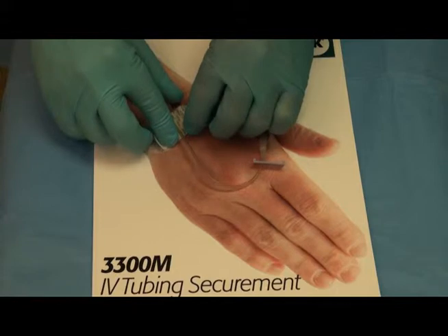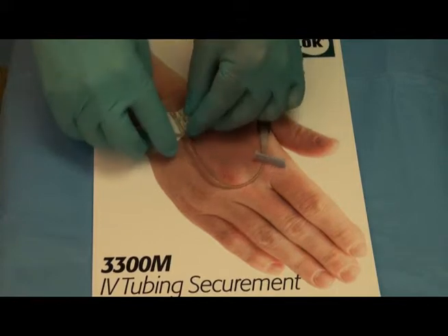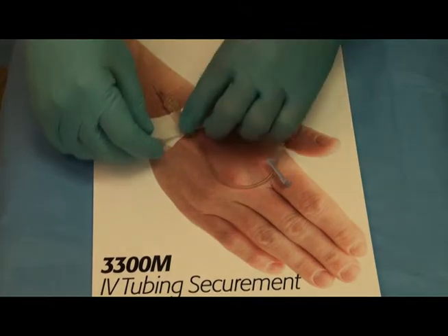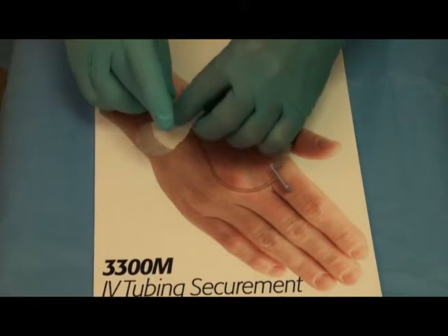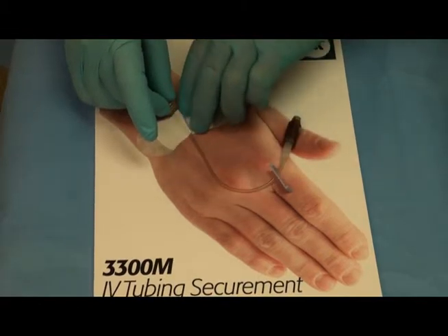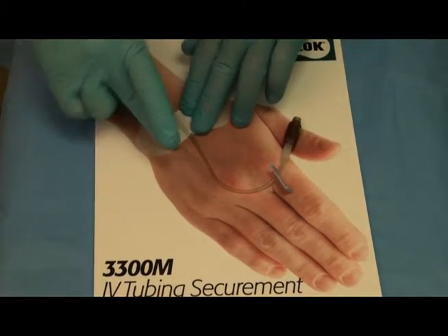Remove the inside adhesive release liner and press the IV tubing onto the exposed adhesive. Secure the velcro fabric cover down over the catheter and press around and on top of the catheter.